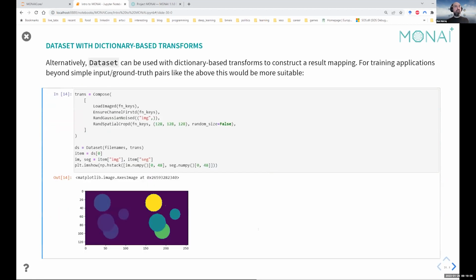And there you go. You can see slightly less noisy spatial crop there. But, oh, that's probably because it's set to not happen automatically every time. All of these random transforms have a default probability of occurring, or you can tune that yourself.